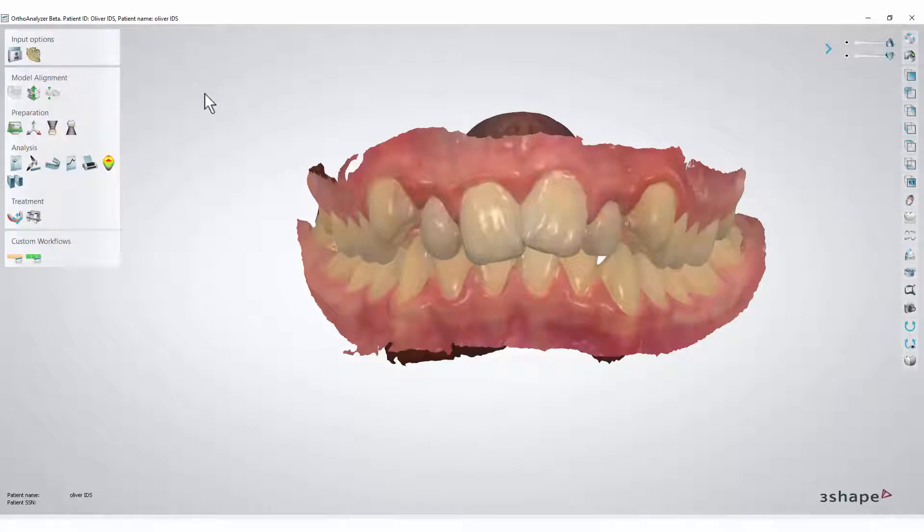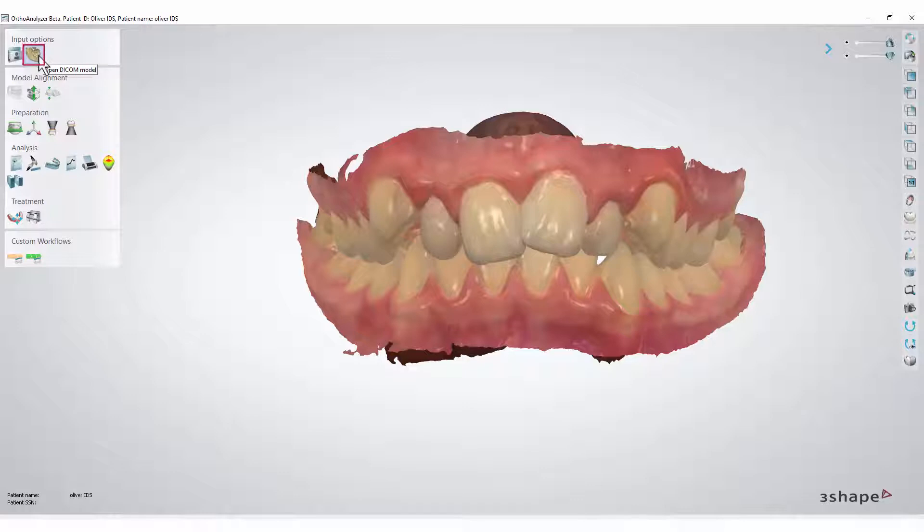To open a DICOM scan from a CBCT, click the Open DICOM Model button.